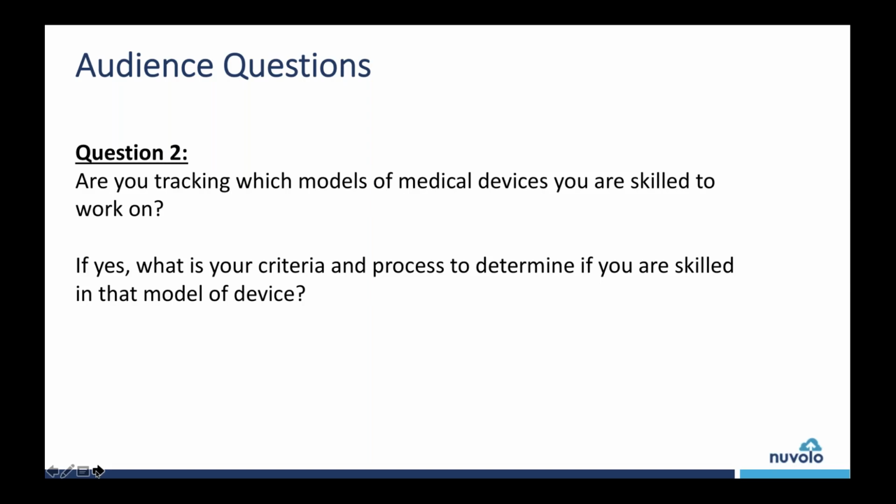What you got? So we do the work. They do the work on the device. They get taught first. They do the ODT first. They do the work on the device. They have an observer watch the preventative maintenance procedure and check the form, and then they go back and they check it again like 3 days later. Got it. There's a loop process.